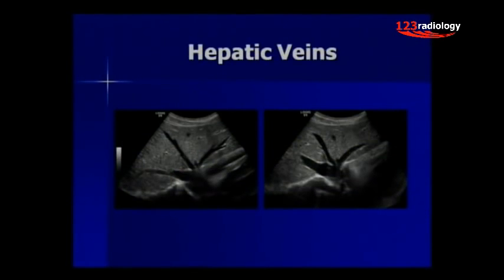In talking about the liver, we are going to be talking about hepatic veins. We're going to talk about how they divide the liver into various segments, looking at the right hepatic vein, middle hepatic vein, and the left hepatic vein.